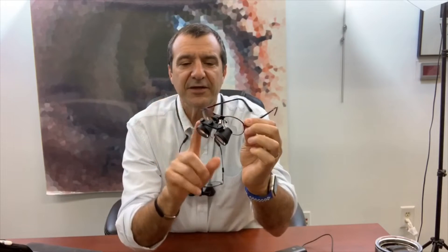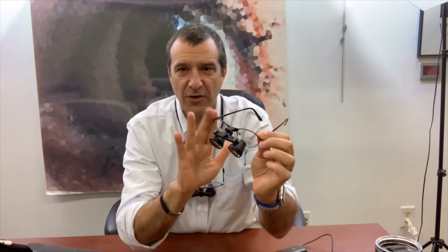They're not a clip-on — they're attached to the frame. They enhance your corrected vision. The reason we want to do that is so you can see above them to watch TV. You can flip the telescopes up and still see the way you normally see with your near correction.